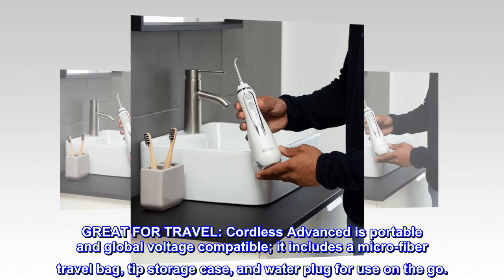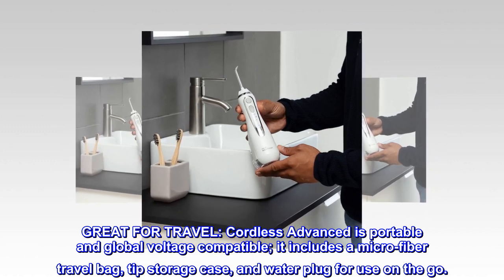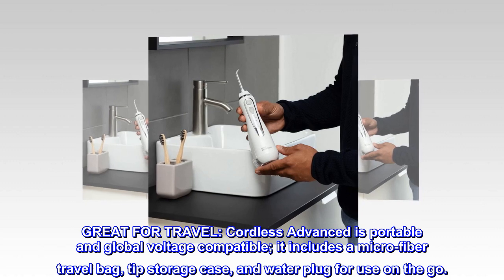Great for travel. The Cordless Advanced is portable and global voltage compatible. It includes a microfiber travel bag, tip storage case, and water plug for use on the go.